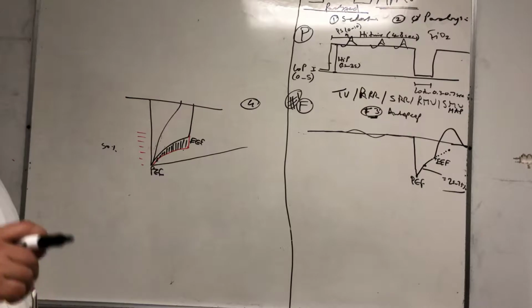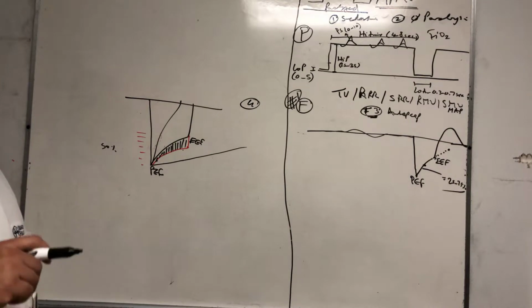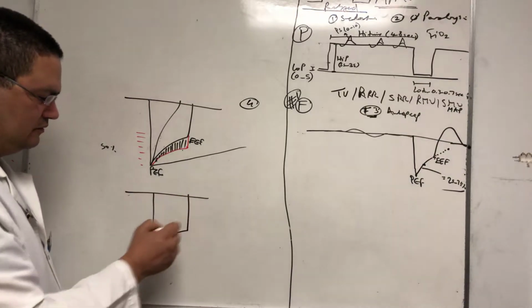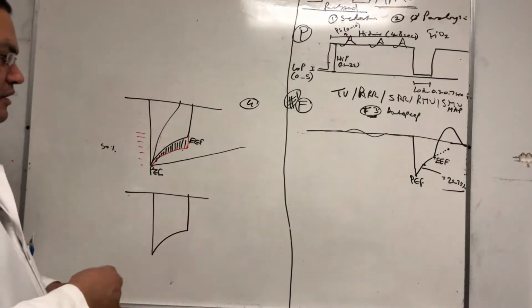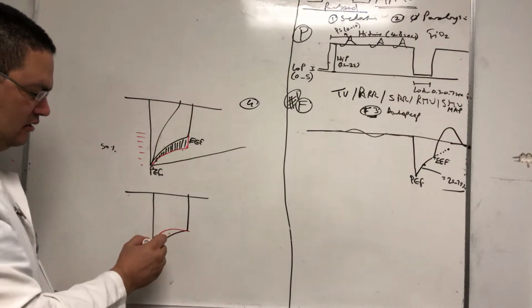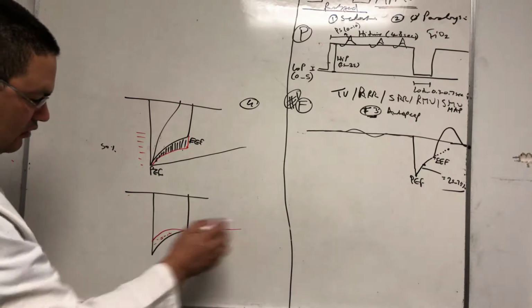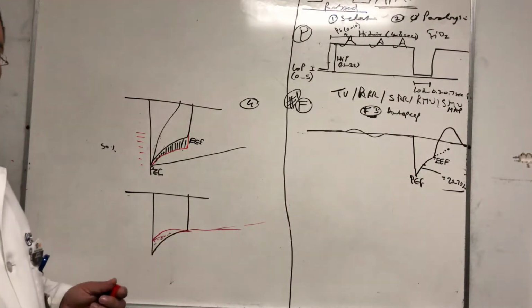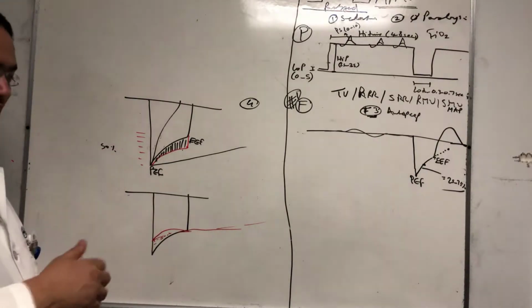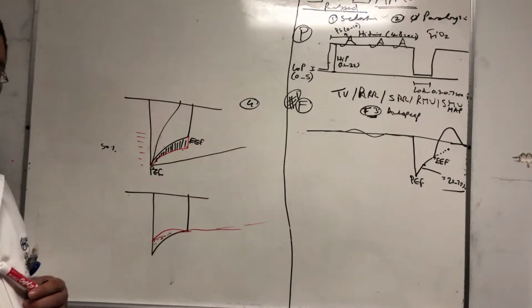In a small percentage of the time, 5% or even less sometimes, this is actually airway obstruction. So the curve looks like this. This is 50% of this. And actually what happened is that this didn't go down, this went up. So this is the area under the curve that is cancelled, less tidal volume. And the wave looks like it's going to take a longer time now. From here to here, it's going to take a longer time to reach almost like a COPD waveform now. But in a bad way, not like this COPD patient, which is actually adding the tidal volume to the patient. This is actually taking tidal volume from the patient.